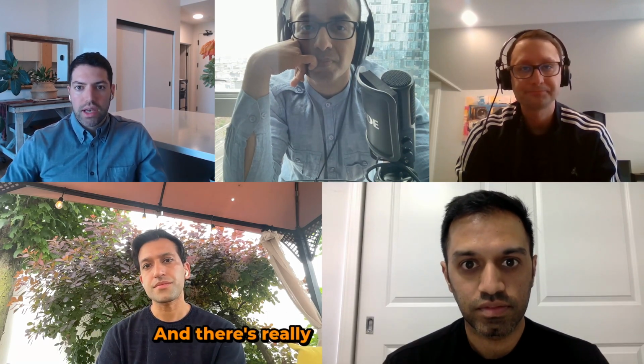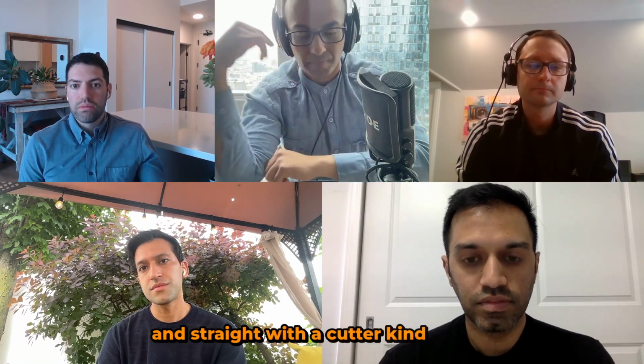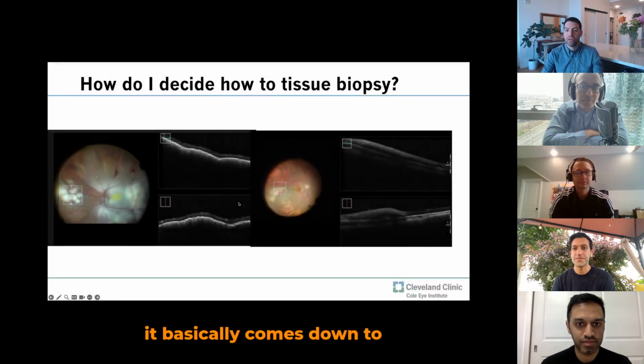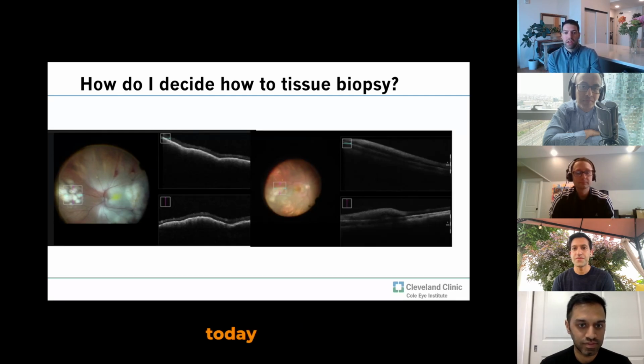And there's really 2 ways I do this. One is a dissection, and the other is just going straight in with a cutter, kind of our retina surgeon version of a fine needle aspirate. So yeah, I can talk about those techniques today. It basically comes down to multimodal imaging for me, and how I decide which of these 2 techniques I do.